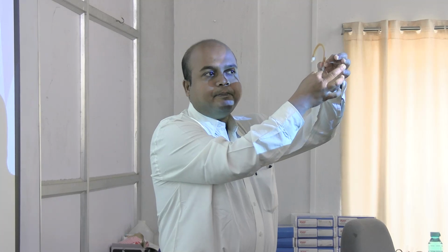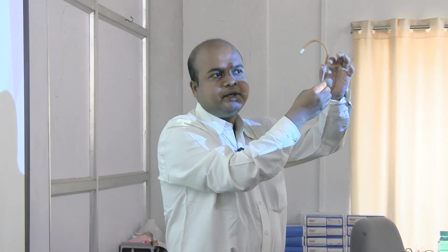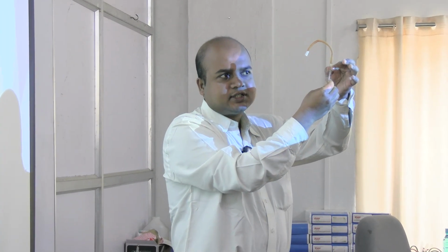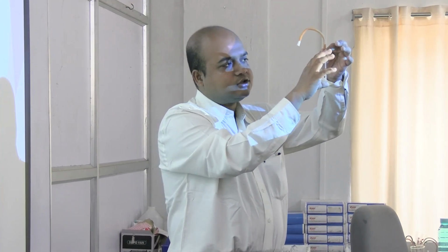After the 0.5 blood, we suck the fluid, which will push the blood up into the bulb. Then rub the bulb very gently with your hand for a maximum of 1 minute, so that the blood and the fluid are mixed in the bulb. Below the bulb is called the stem of the pipette. Strictly speaking the stem extends above the bulb also, but casually we say this is the stem, the lower part of the stem.